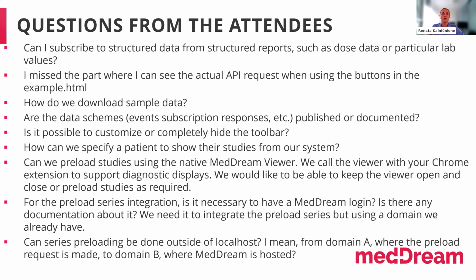Okay, so I'm reading the last question. If somebody else has more questions, please write them now. Can series preloading be done outside of localhost? I mean, from domain A, where the preload request is made, to domain B, where MedDream is hosted.